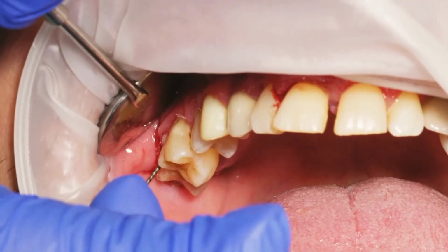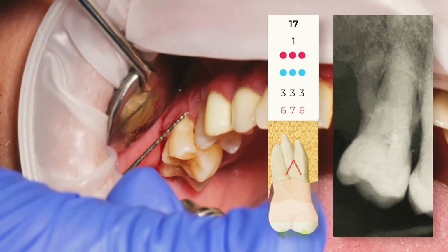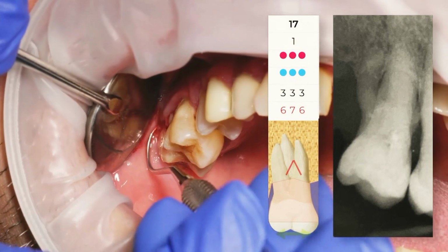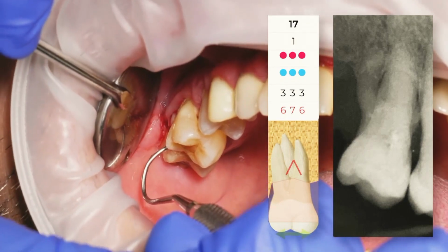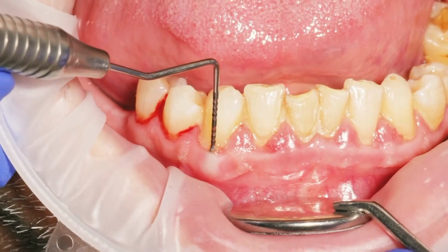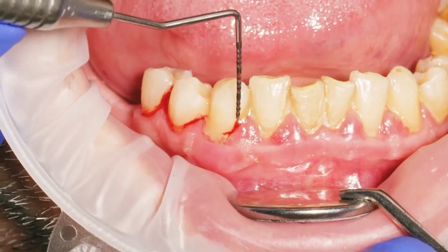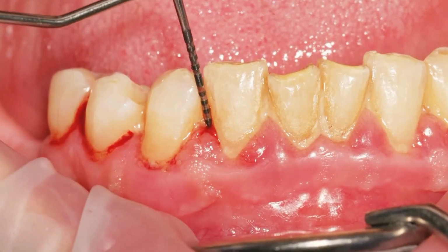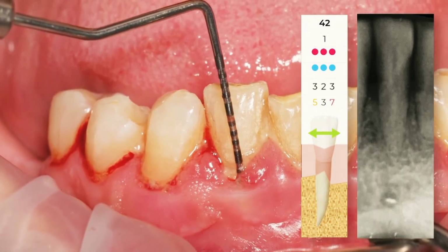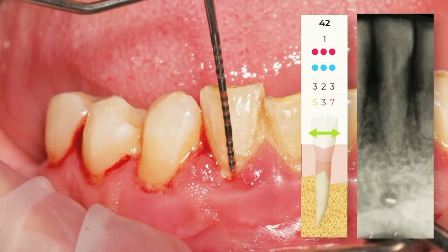So you can see here and here the use of the Nabers probe, the angulated probe, to check the furcation lesion, like in this second molar, where we have 6 millimeters probing pocket depth and also a furcation lesion. And we do the same in the lower teeth, following the same steps.